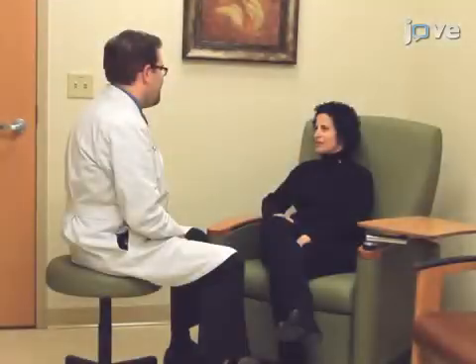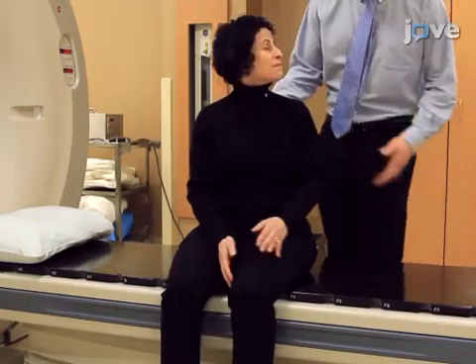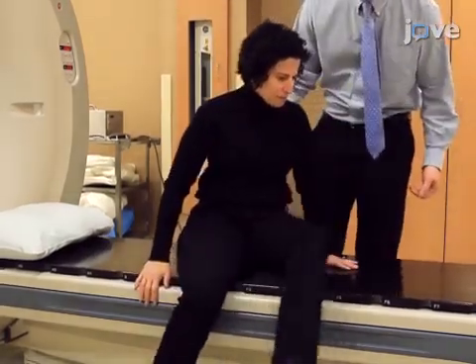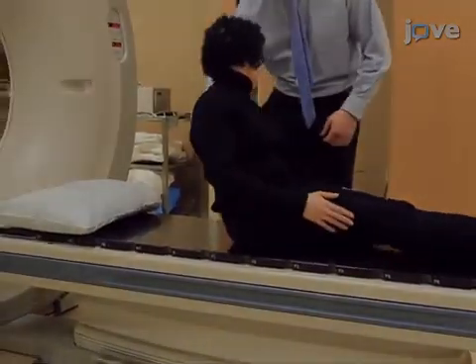Before beginning the procedure, describe the new lung SBRT treatment to the patient and discuss the treatment risks. To perform a percutaneous CT-guided or bronchoscopic placement of a single gold-coated marker is then carried out.